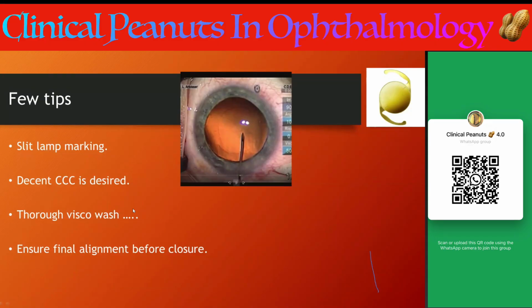So ensure final alignment before closure. I mean, even if you are hydrating your wound, after that you should see whether the alignment is perfect or not, because sometimes even the hydration of the wound can lead to slight misalignment.